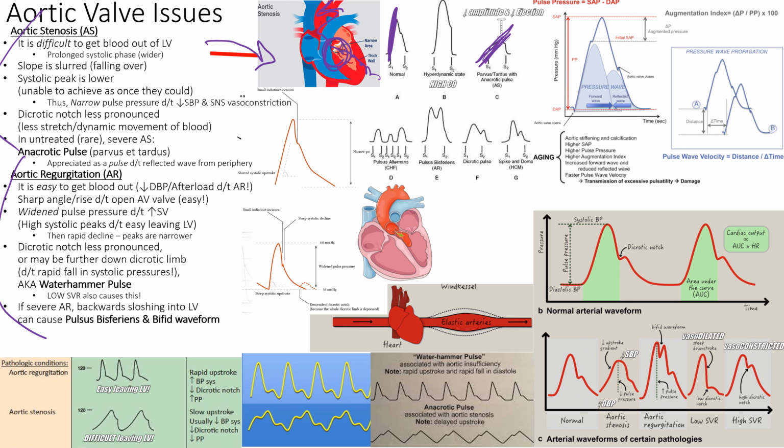And we can't get a lot of blood out. We can't really get all the stroke volume we would like. So the height is also decreased. So when compared to where it was to where it is, it's going to be reduced, right? And then the body's going to say, what the heck? Where's all my stroke volume at? Where's my systolic blood pressure? And what is it going to do when it doesn't get the blood pressure it needs?